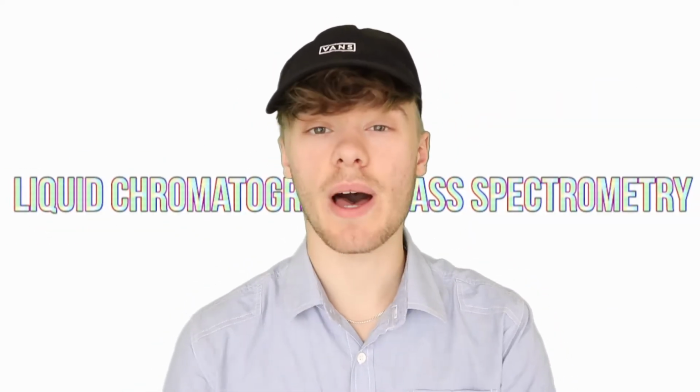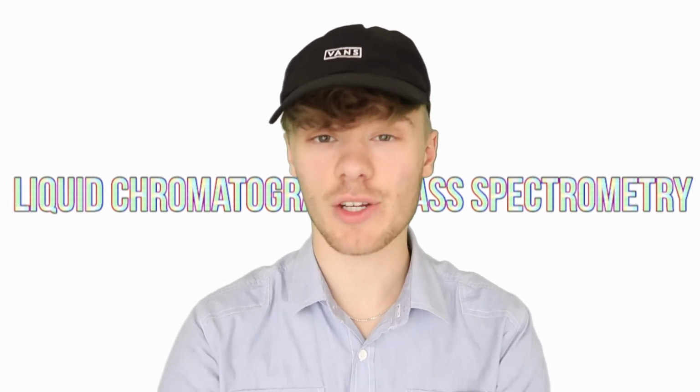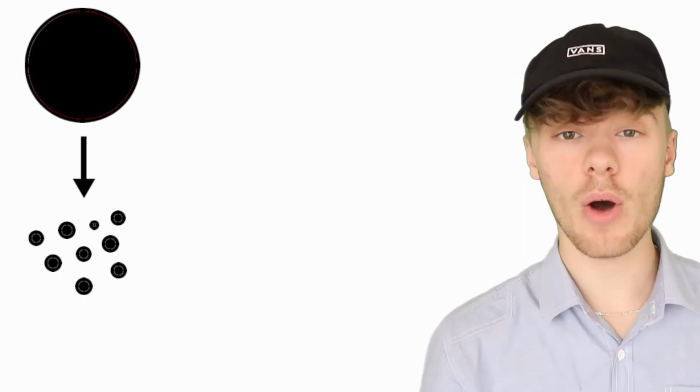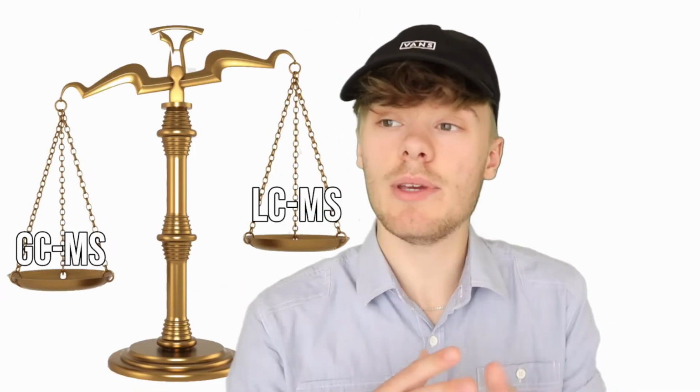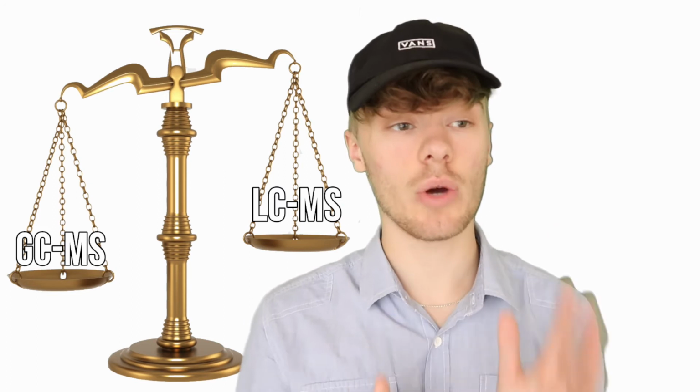So what about its counterpart, liquid chromatography mass spectrometry? Similar to GC, liquid chromatography will separate the sample components and introduce them into the mass spectrometer. This instrument is known to be important in several areas of science, such as clinical biochemistry, and is known to compete with conventional techniques such as immunoassay. This at times may be chosen over GCMS as it's known to analyze compounds that it can't. For example, if they're not thermally stable or non-volatile.